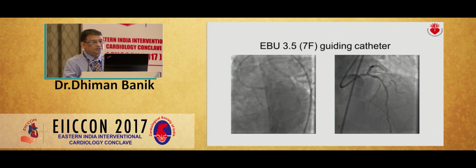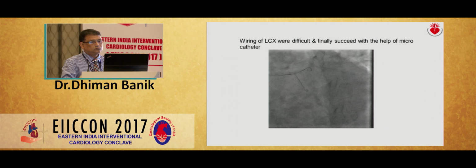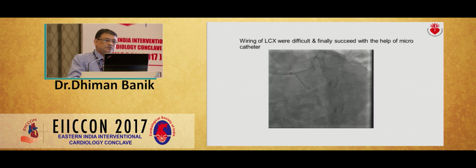During PCI, this was the view. I wired the LAD first with a Runthrough floppy wire. Wiring of the LCX was very difficult, and I finally managed with the help of a microcatheter. What wire have you taken for LCX? Runthrough floppy wire. The angle was very difficult to cross, and finally I managed.